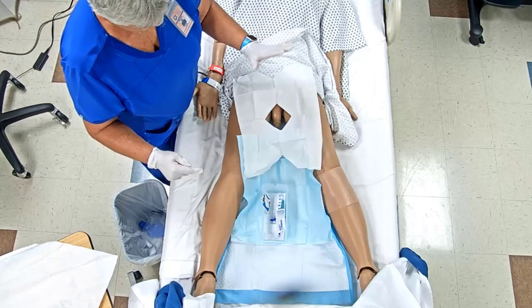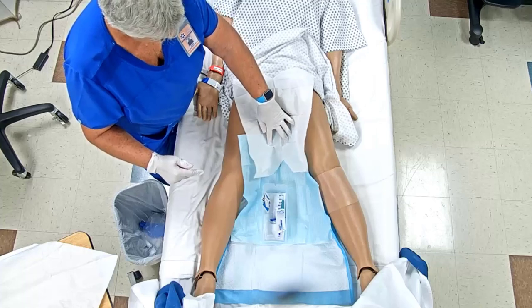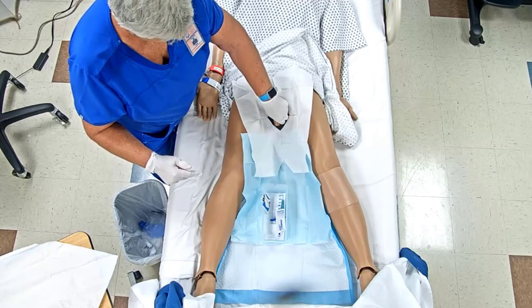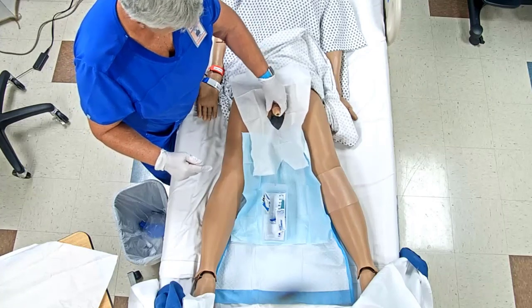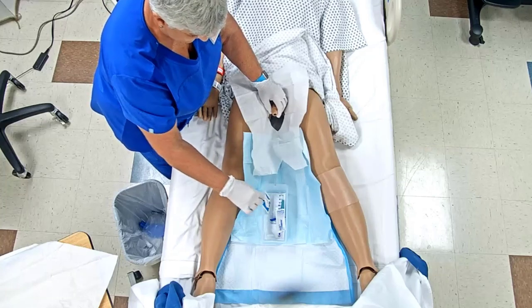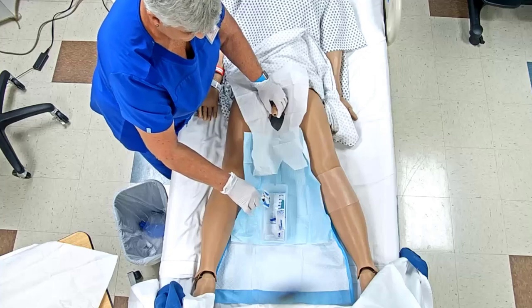All right, so with this hand, my non-dominant hand, I'm going to go ahead and just push these drapes down, okay? And then I'm going to grab the penis, okay? And we're going to pull it up. And now I'm going to get my first, making sure my gloves do not come in contact with that drape.